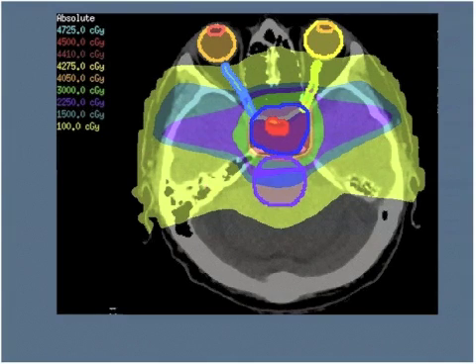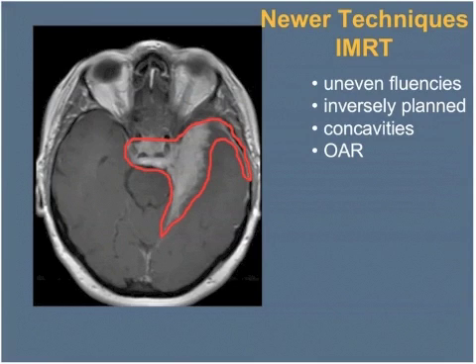So in this instance, we're giving about 4,500 centigray to the center, and then this low-dose wash is down at around 100 centigray, so about just a few percent of the prescription dose. And so the idea, a fairly fundamental principle in radiation oncology, is this idea of accepting larger low-dose volumes in order to concentrate the high-dose volume in a fairly discrete area, and using multiple non-coplanar beam arrangements to achieve that.